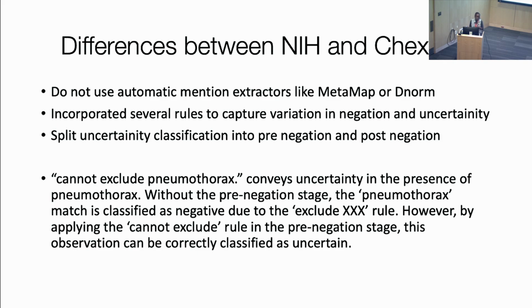A lot of work was done by Frank and Theo, who are our postdocs, to really go back and, number one, use the ACR dataset, which has human annotations, which are segmentations, as the ground truth to train a model for pneumothorax, and then do inference. Those words should be making sense for everyone because of yesterday, right? So do inference, test the model on the Emory dataset, which is based on the image, and then see where the model says this is positive, and where there is model image versus report discordance, and then review that and fix that.